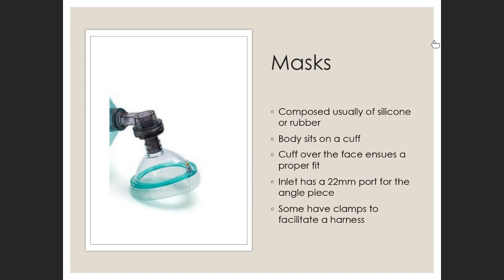Shanique, where are you? Okay, Bilal says LMA. You just woke up, Bilal. Morning. Shanique, sorry. The LMA. Okay. Tonya? Laryngeal mask. Veronique? Laryngeal mask.